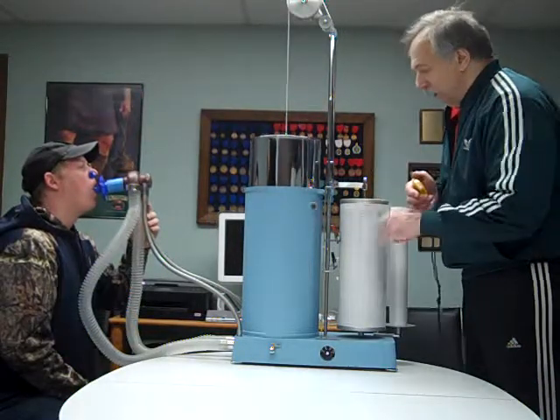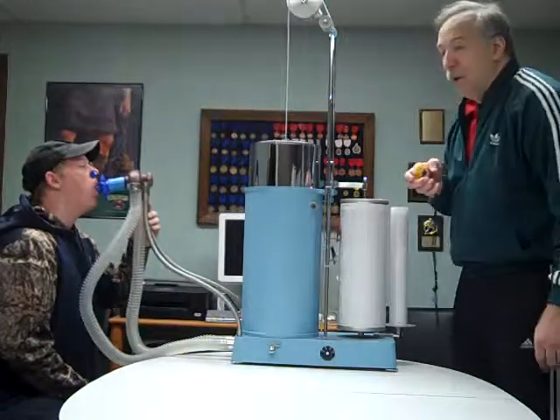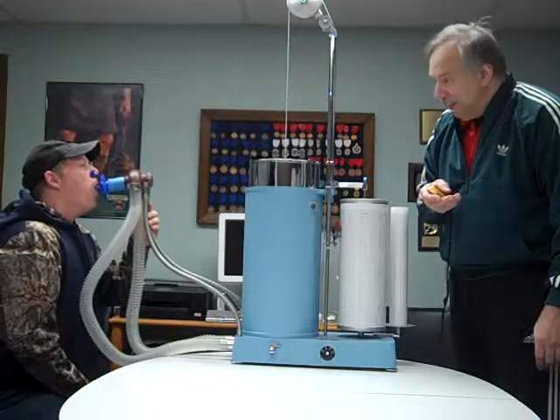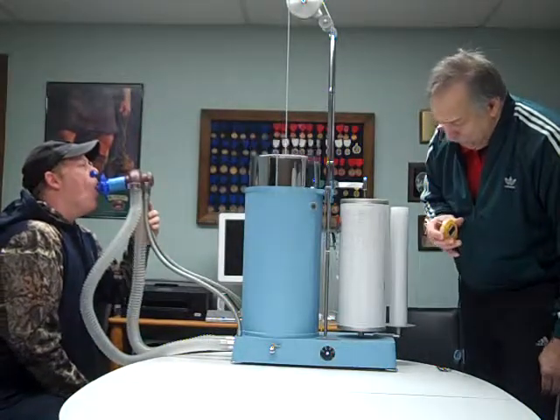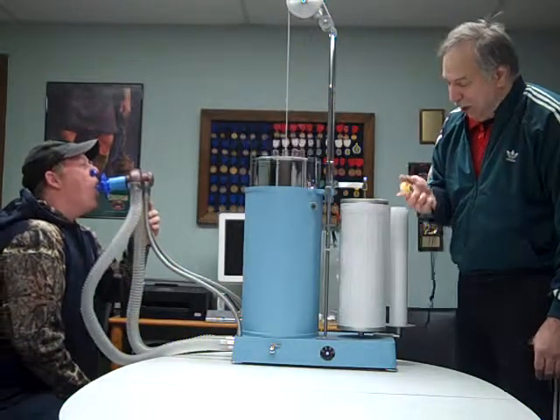Okay, you ready? Flip the finger. On your mark, get set, go. He's going quickly and fast — that's it. Hard is fast. 50% to 75% — that's good. Excellent, just keep it going. A couple more seconds to go. We're about halfway there, a little bit more. Almost done. Three more seconds — come on, push through it. Stop.